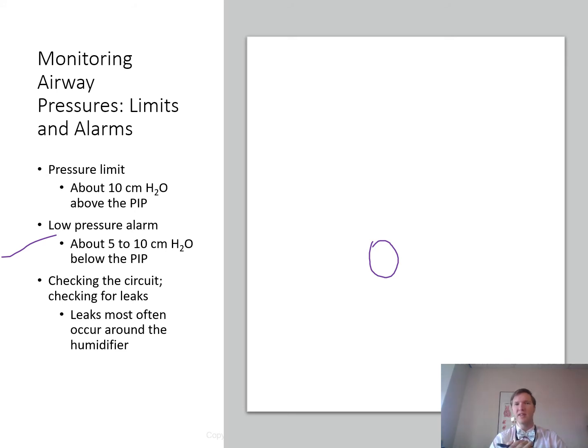So it's very important that no leak exists when we're looking at other things like VD/VT, oxygen consumption, like metabolic studies. That's going to be very important when we look at indirect calorimetry as well. So in those situations where we can't have a leak, make sure that we have a cuff that's sufficiently inflated to occlude the airway completely. Once we obtain our measurements, then we could go back to our MLT technique or reinflate it to their previous low pressure that they were once using.